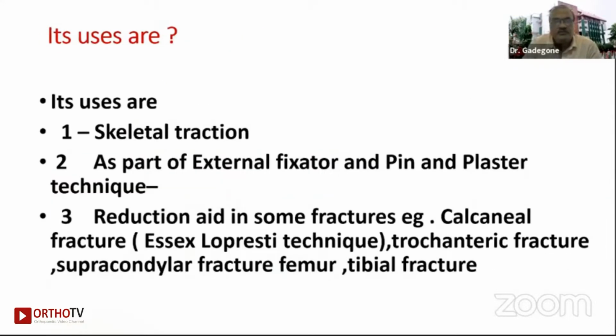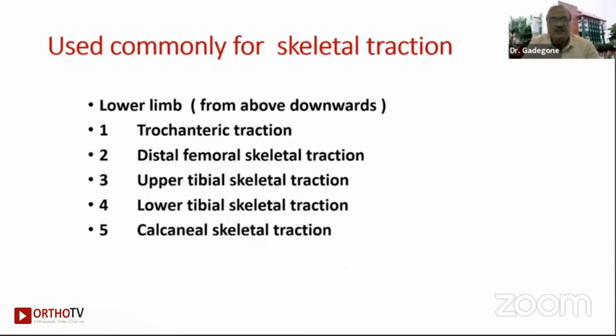It is used for skeletal traction, as a part of external fixator, and as a reduction aid in some fractures like calcaneal fractures, trochanteric fractures, supracondylar femur, and tibial fractures. I commonly use it for skeletal traction, as you know: trochanteric traction, distal femoral traction, upper tibial skeletal traction, lower tibial skeletal traction, and calcaneal skeletal traction.